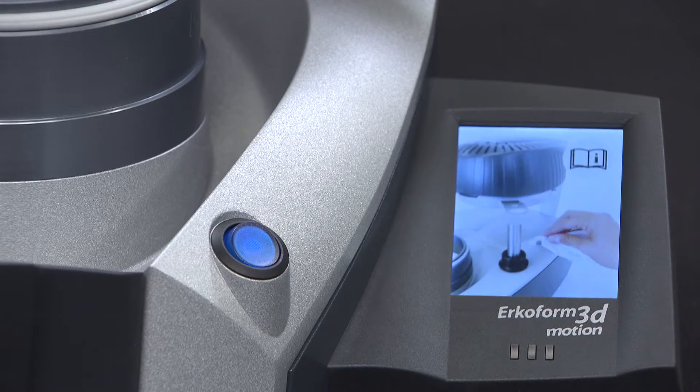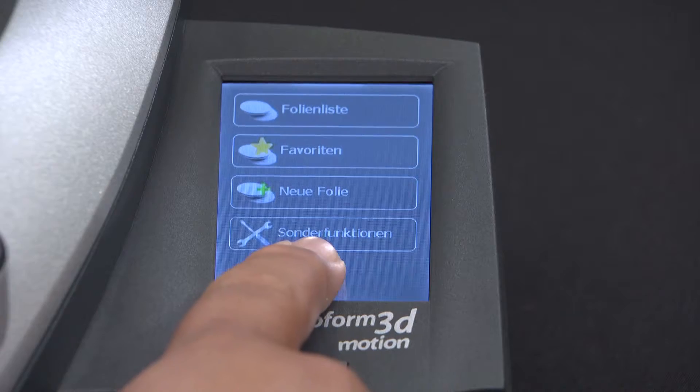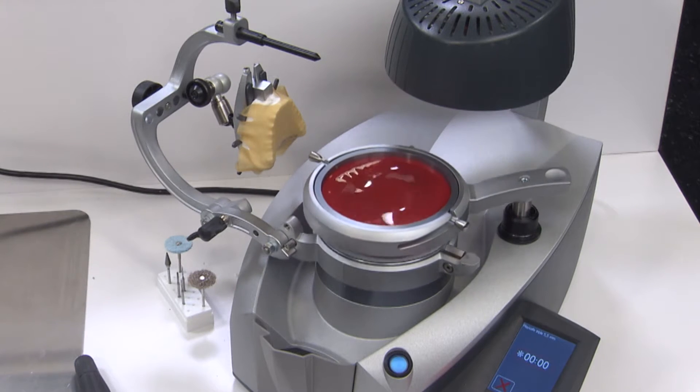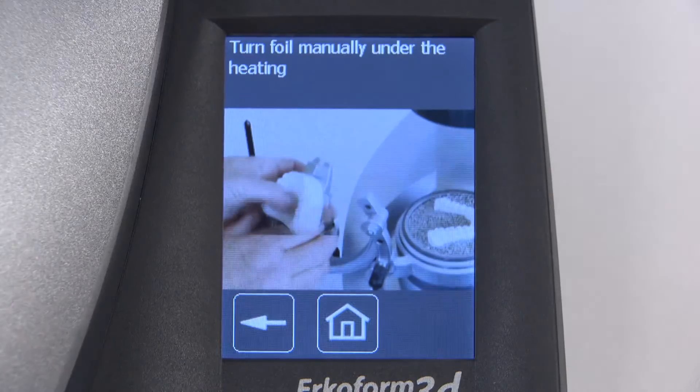The ERCOFORM 3D Motion introduces a significant upgrade to the internal computing unit. The automated vacuum process is now faster and more accurate. The full-color, user-friendly display guides users through step-by-step instructional animations.